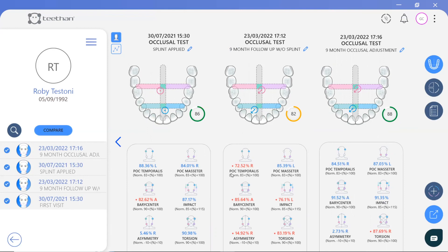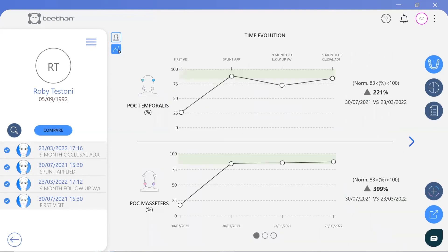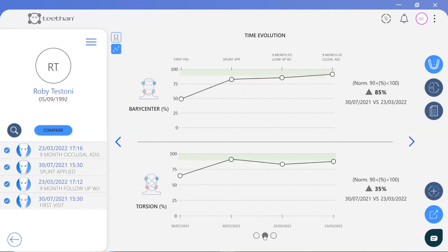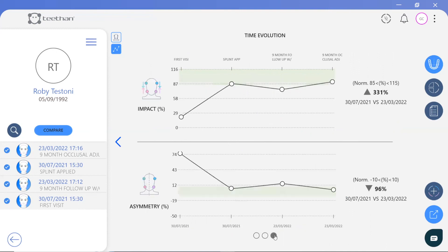Patient progress can also be viewed graphically over time, with green bands indicating a normative range for each value. This is particularly powerful for insurance work and legal protection for the practice, enabling the patient journey to be documented right back to the first visit, whilst also improving patient communication.